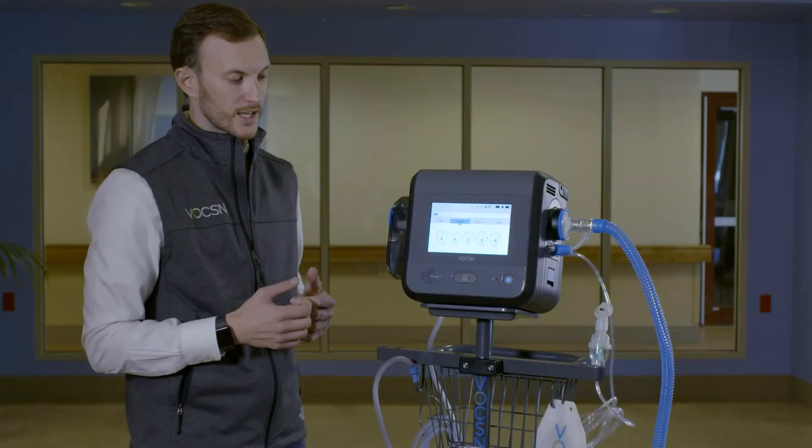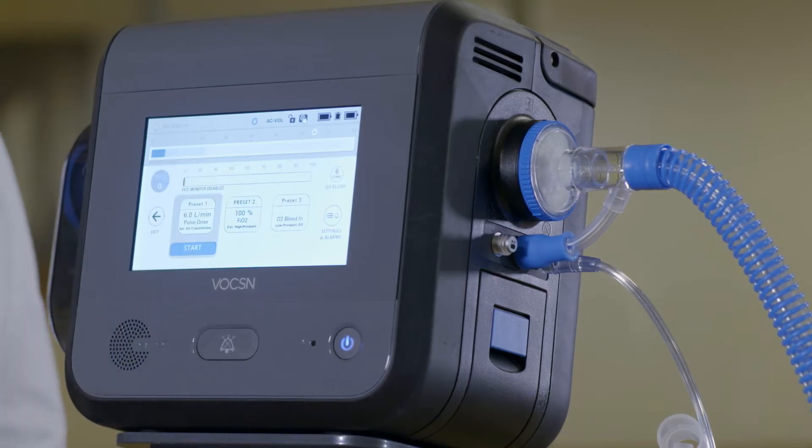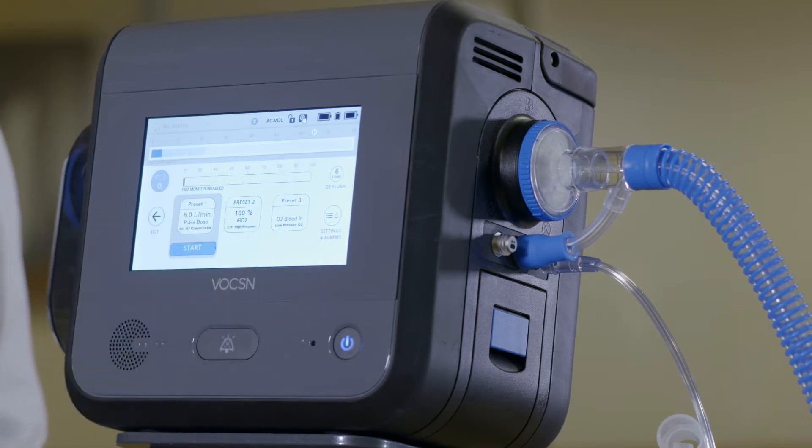Voxxin has an on-board oxygen concentrator. I'm going to go ahead and hit the O for oxygen. You're going to see three presets. In this case, I haven't named them at all, so it's simply preset one, preset two, and preset three.